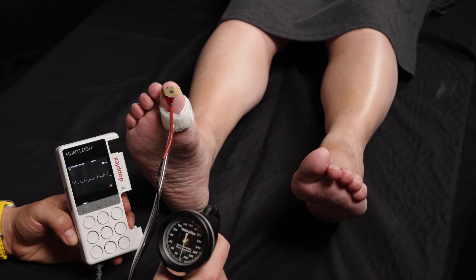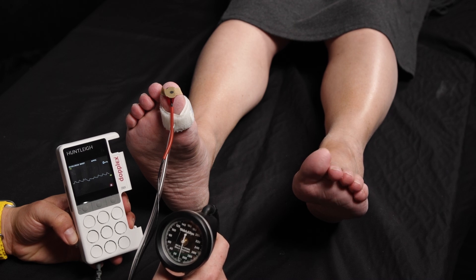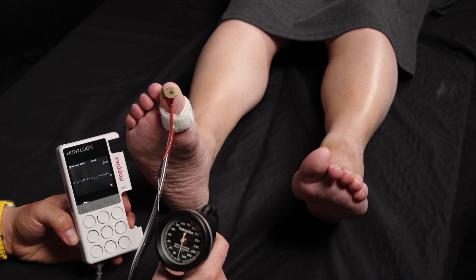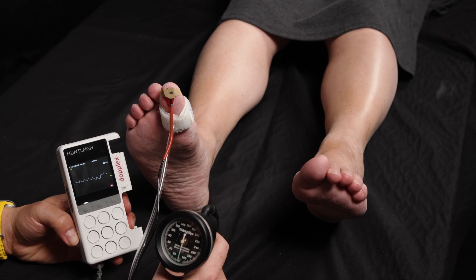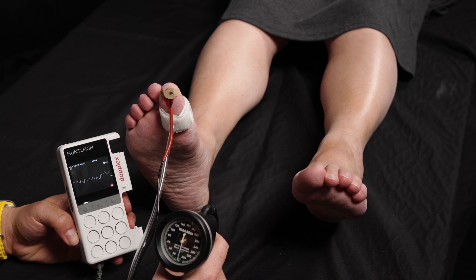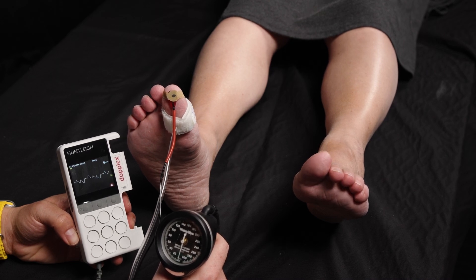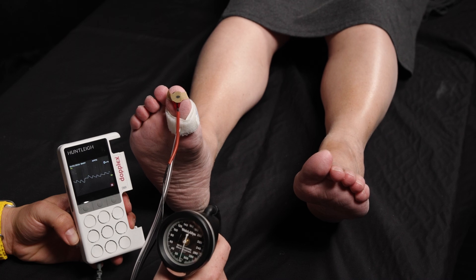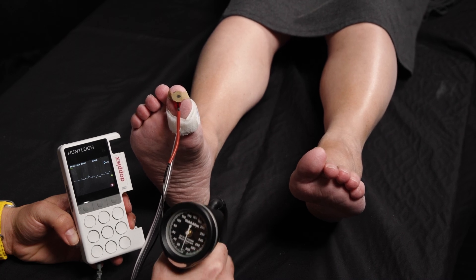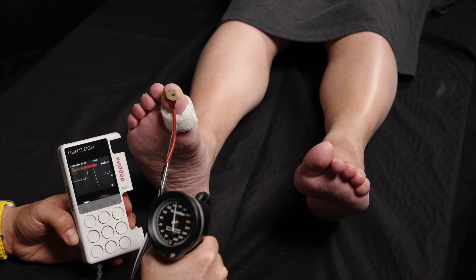So now I'm ready to take the measurement. You can see on the screen we've got a nice regular PPG waveform. It does look different to our Doppler waveform — it doesn't have resistance and it's smaller — but that looks quite normal. So I'm ready to inflate the cuff, and I'm going to inflate nice and steady.